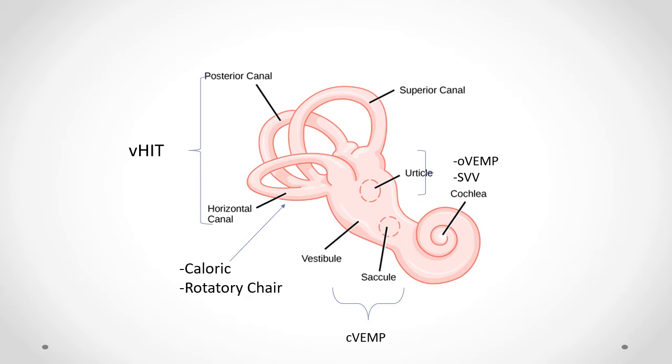Several laboratory vestibular tests are available. As we know, both the caloric and rotating chair assess the lateral canal functions, the easiest to stimulate as compared to the other canals. So the response from each ear can be assessed independently in the caloric test, while both ears are tested simultaneously in the rotatory or rotating chair test.